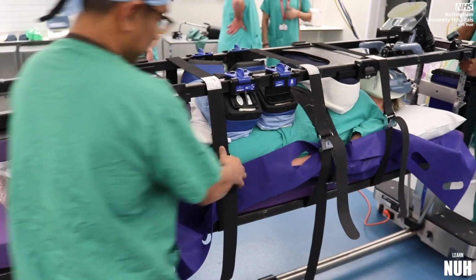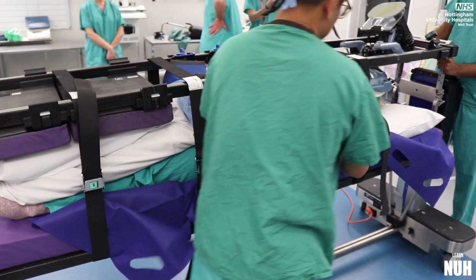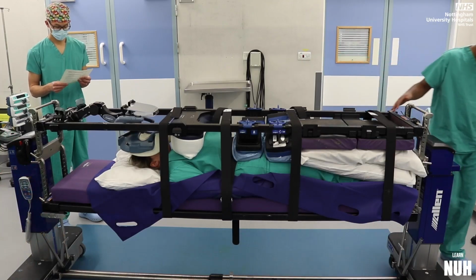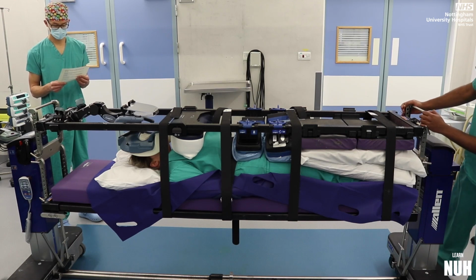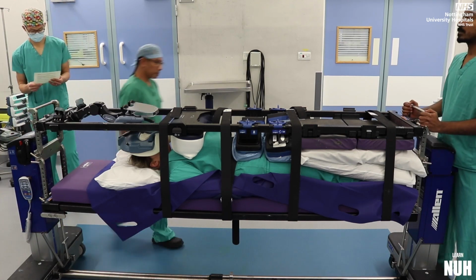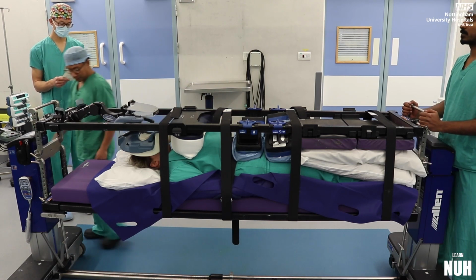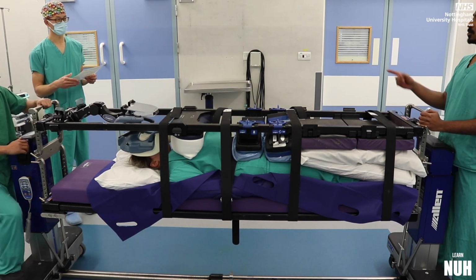Check, are all straps on and secure? The strap releases should be in an accessible position. Check, is the catheter bag secured so as not to snag on the turn? Check the patient monitoring leads position so that they will not snag on turn, and if in doubt, disconnect.